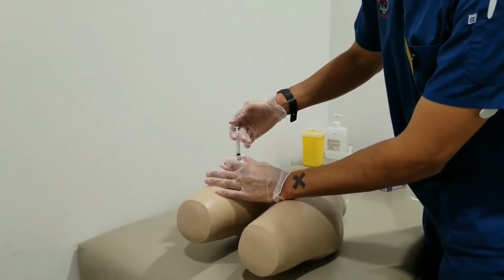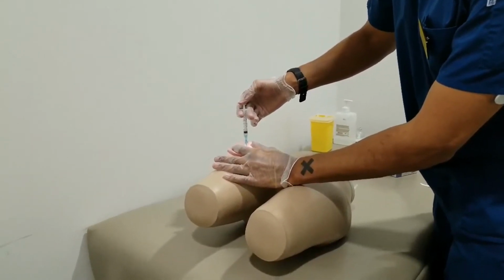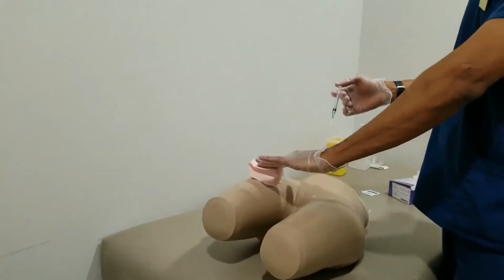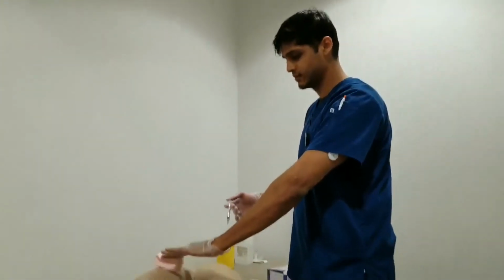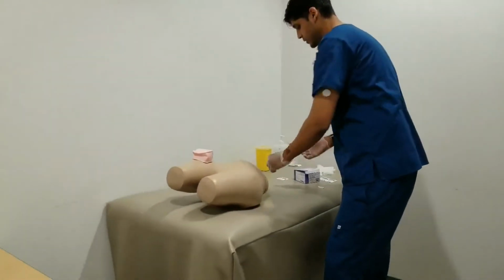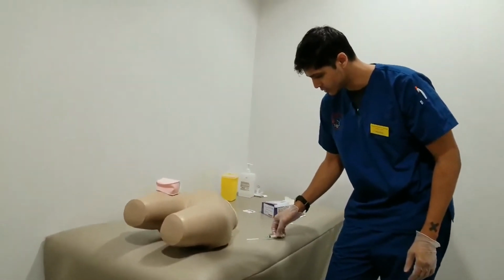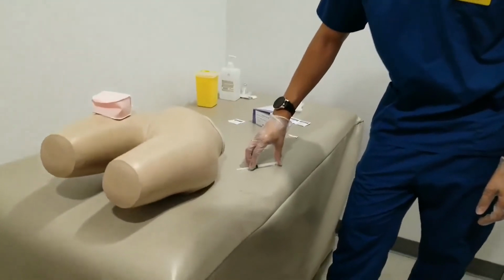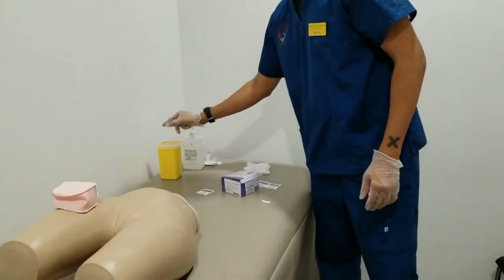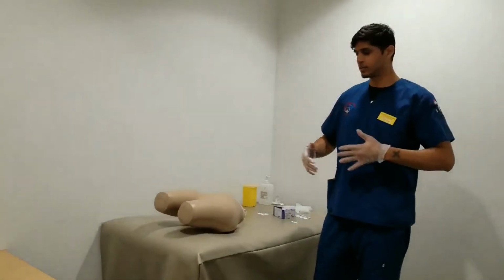Once it's there, I'm holding it in for about 10 seconds and remove the needle, pushing it out of sight. Okay, put the sheath on using one-hand technique. You want to make sure safety is looked after so you don't hurt yourself. Then dispose. Alright, so now both subcutaneous and IM injections have been administered.